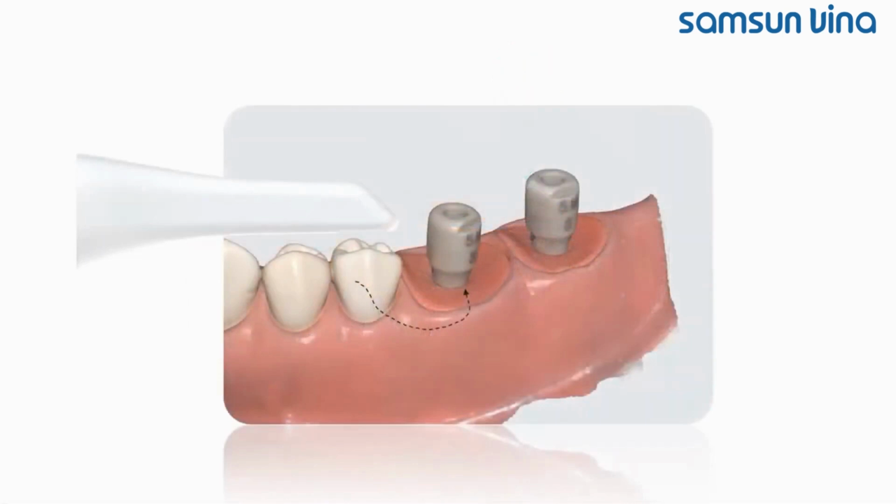Start scanning an adjacent tooth of the restoring site and acquire the data slowly. Try to capture as much of the scan body data as possible.